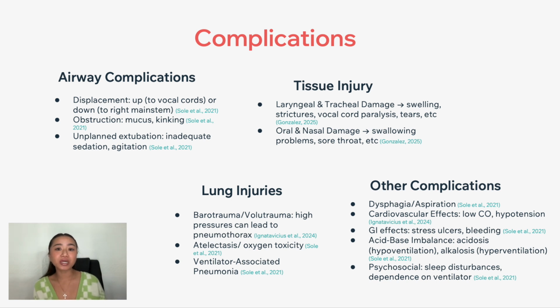The tube can also become obstructed by mucus, kinking, or even if the patient bites down. And also, unplanned extubation is a very real risk, especially if the patient is agitated or poorly sedated. So it's really important to have those tubes secured, and we monitor those patients closely.